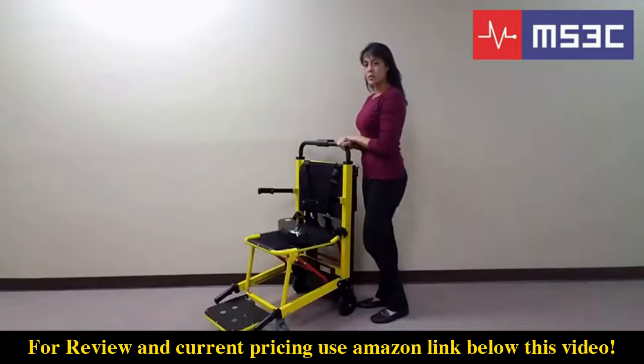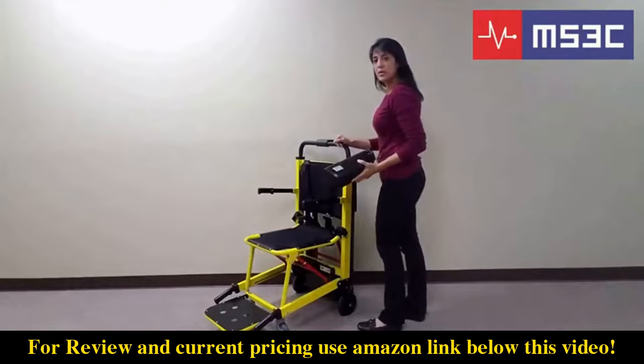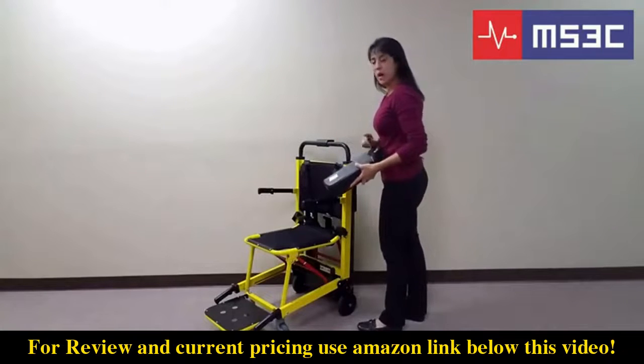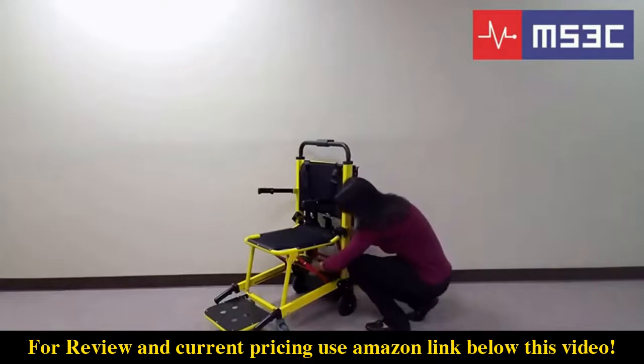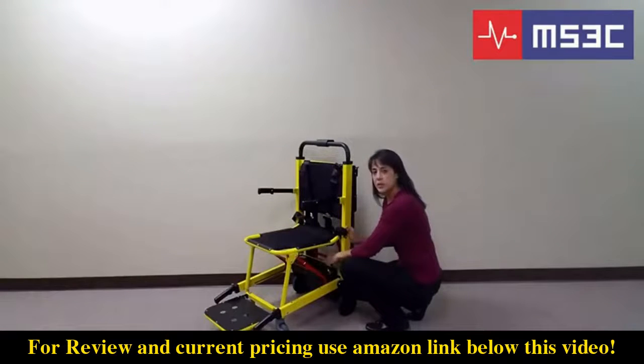Now that you're familiar with the chair's basic features and operations, we're going to show you how to prepare it for ascending and descending flights of stairs. First, you will need to install the battery. Take the battery and slide it onto the battery rail located underneath the seat. The key side should be up. Once you slide it on, you can lock it into place with the key.